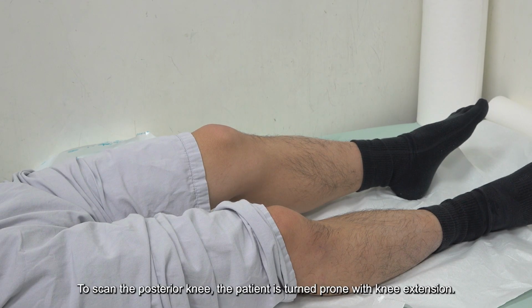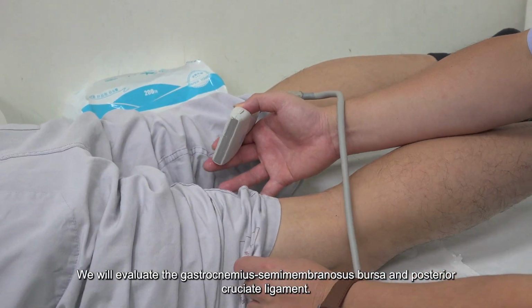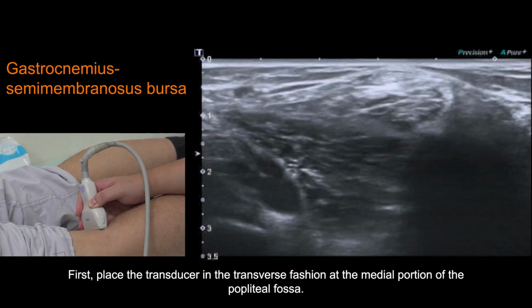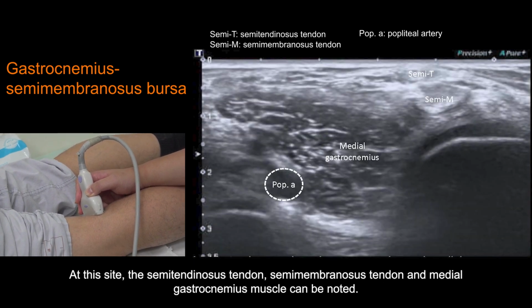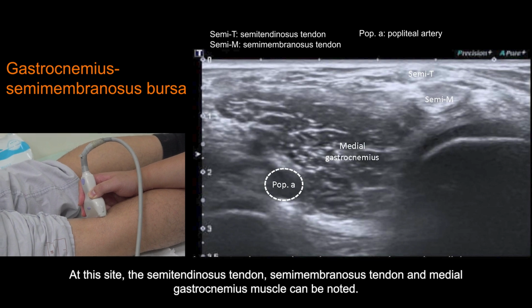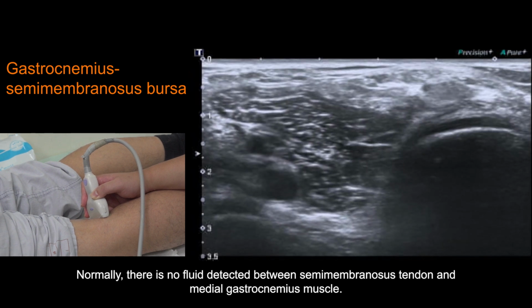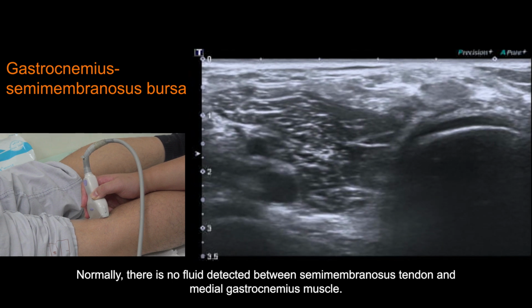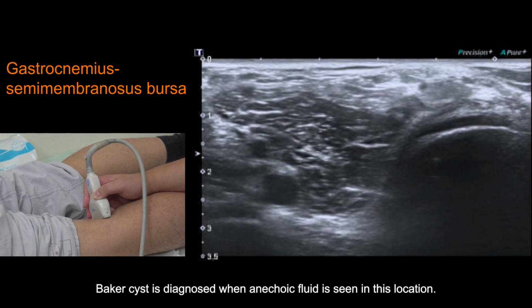To scan the posterior knee, the patient turns prone with knee extension. We will evaluate the Gastrocnemius semimembranosus bursa and posterior cruciate ligament. First, place the transducer in a transverse fashion at the medial portion of the popliteal fossa. At this site, the semitendinosus tendon, semimembranosus tendon, and medial gastrocnemius muscle can be noted. Normally, there is no fluid detected between the semimembranosus tendon and medial gastrocnemius muscle. Baker's cyst is diagnosed when anechoic fluid is seen in this location.